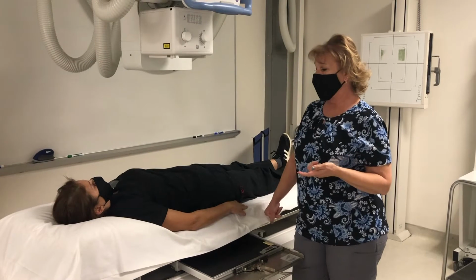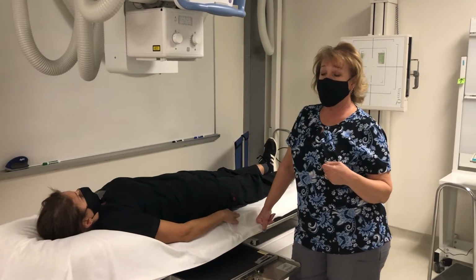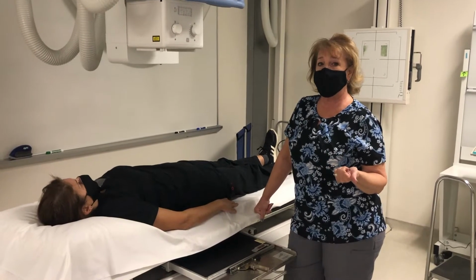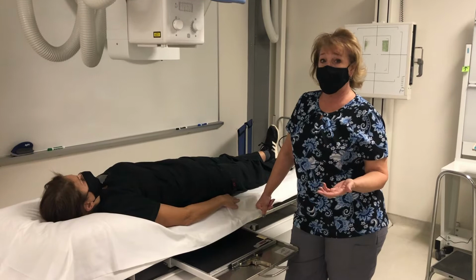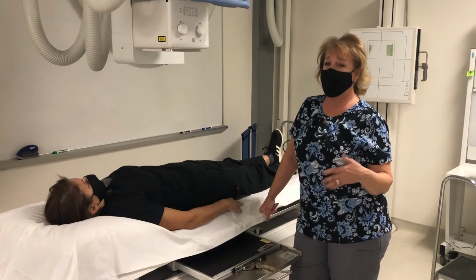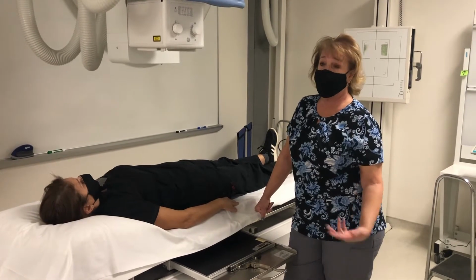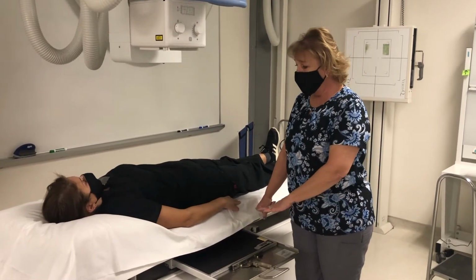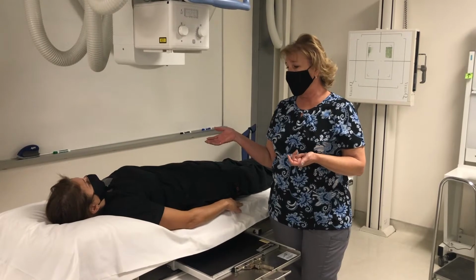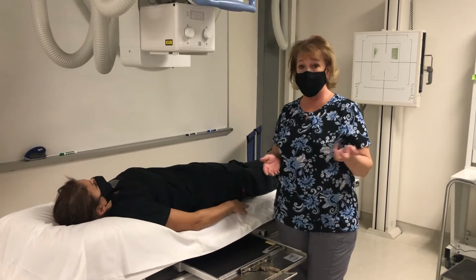Also, prior to injection of contrast, I would have taken a history, making sure that she's not allergic to iodine, which shellfish actually has a high concentration of, so that's sometimes one of the questions you ask: are you allergic to shellfish? Because if they can eat shrimp and crab and things like that and have no problem, then they probably don't have an iodine sensitivity. I'd make sure she had nothing to eat or drink since midnight. And if her scout film looks clear, then I would set up to do the upper extremity venipuncture, probably administering between 50 and 60 cc's of Omnipaque or whatever contrast the department is using.